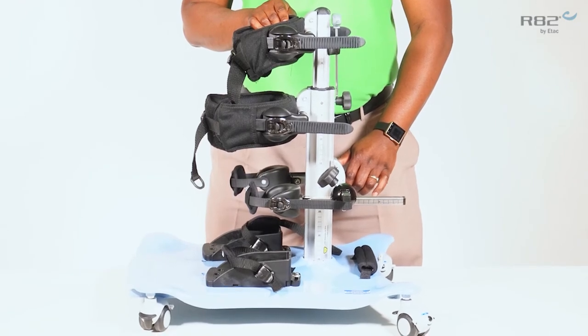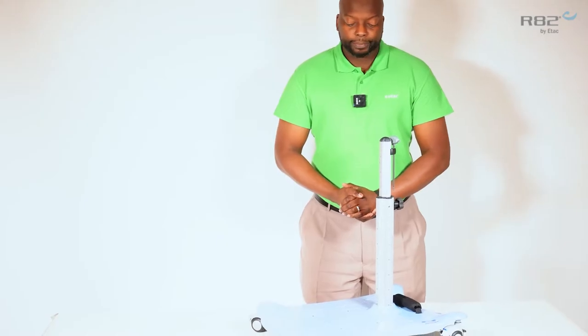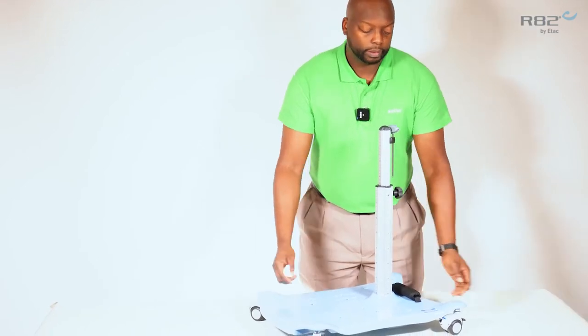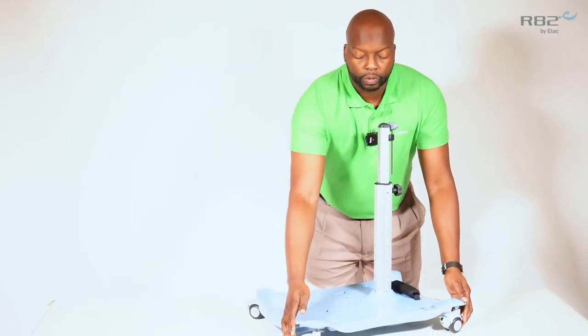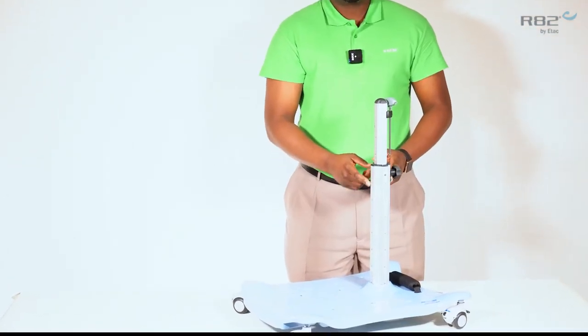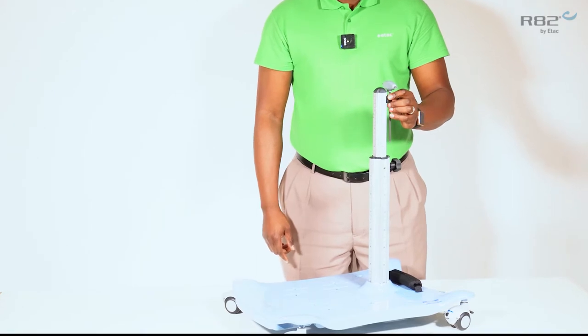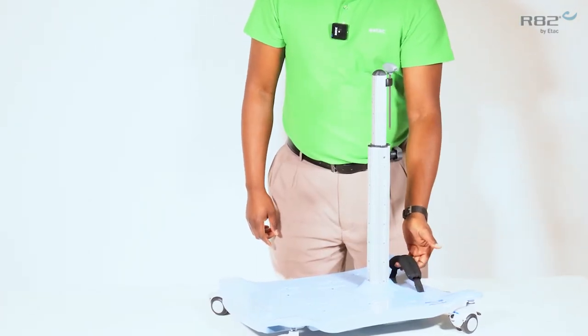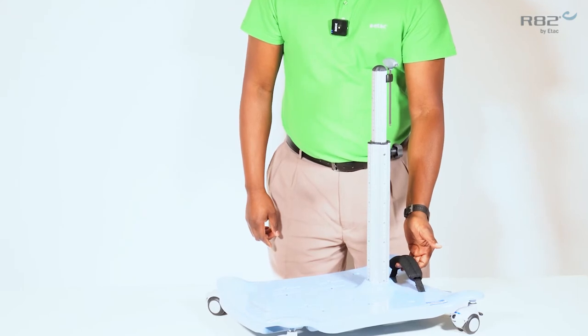Some of the standard features of the Meerkat include the base plate, four swivel locking casters, a height adjustable column, a hex key used for adjustments, and a handle used for the rocker panel.